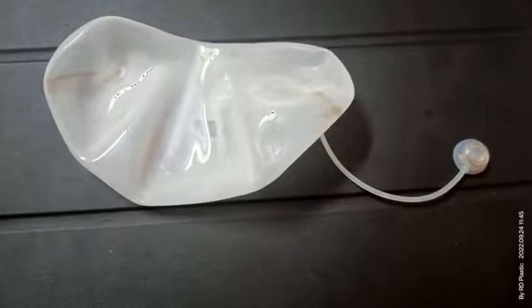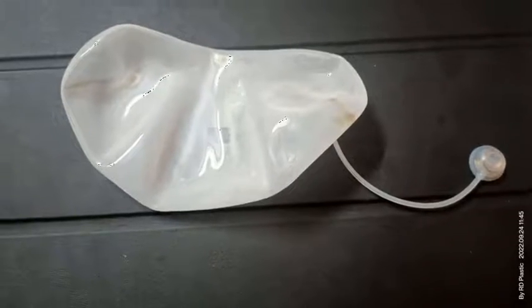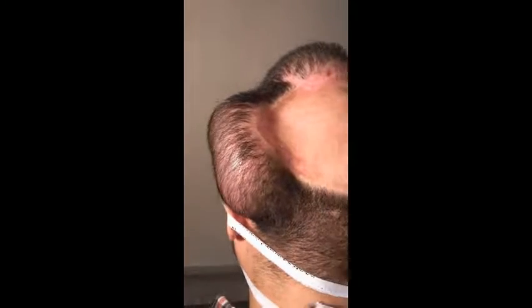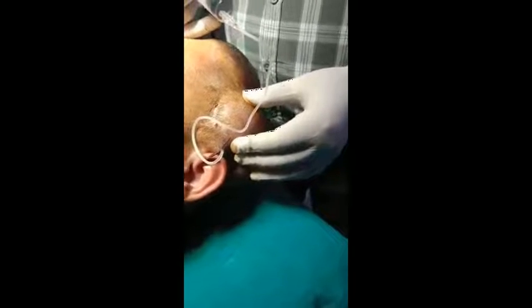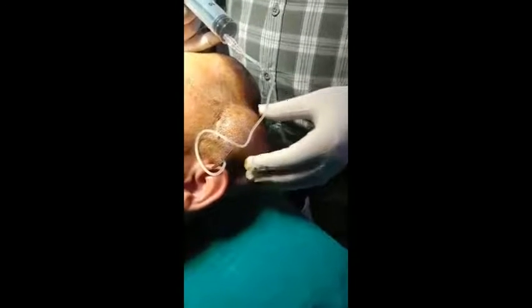By expanders you mean these are silicone shells which are regularly inflated with saline, so that we create 3 artificial tumors on his skull with a huge extra skin, so that at the end of the time, when we are sure that the skin is enough, we remove these expanding shells and replace and cut the skin graft and resurface the scalp with a hair bearing scalp. So that is exactly what we have done.